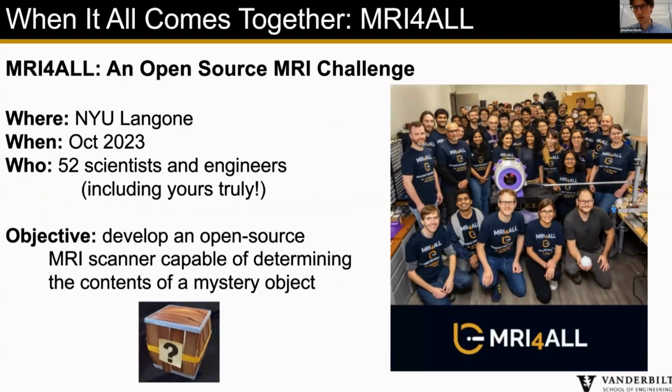As I said, this was in October 2023. It was hosted by NYU Langone. And about 50 scientists and engineers all participated. And I was a part of the acquisition software team. So trying to not bother ourselves with reconstruction or UI, but just work on making hardware control for running pulse sequences happen, essentially. And our objective was to develop an open source MRI scanner capable of determining the contents of a mystery object, some unknown phantom with an unknown content that we were trying to determine the identity of.